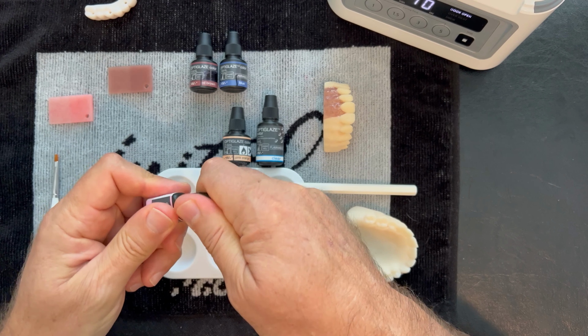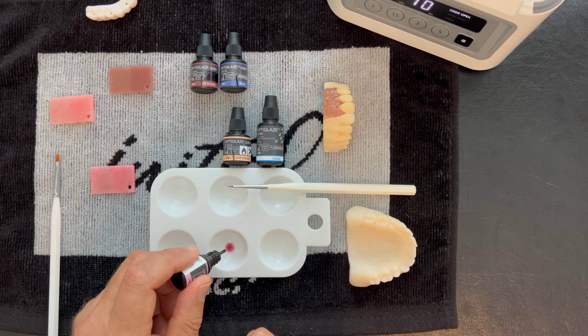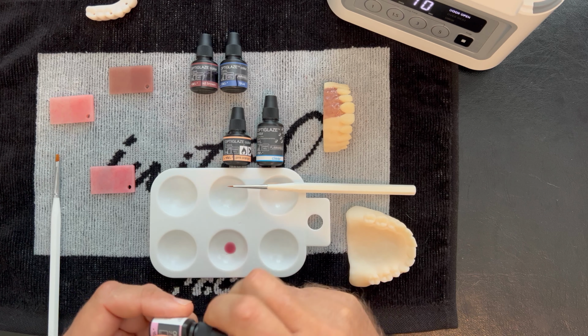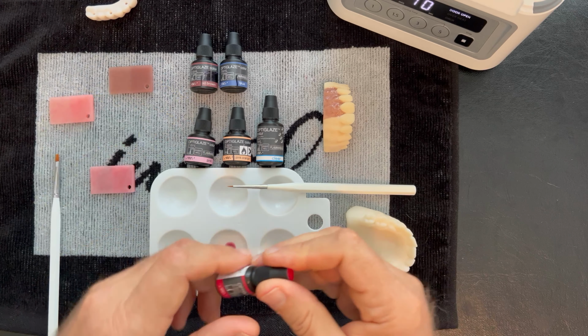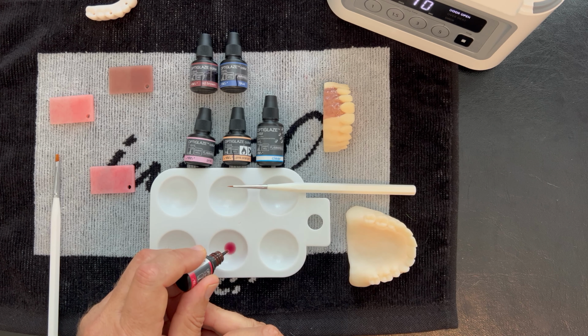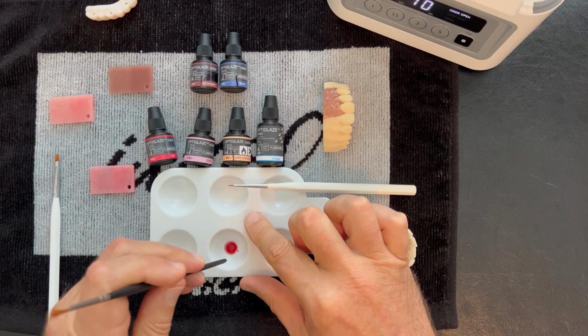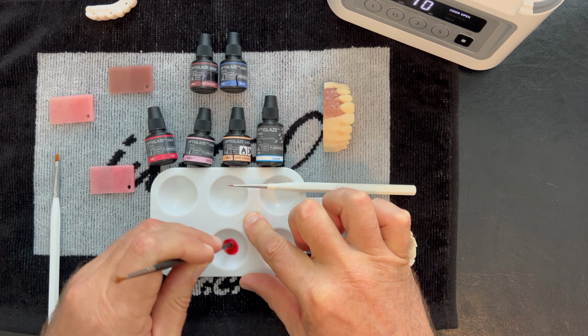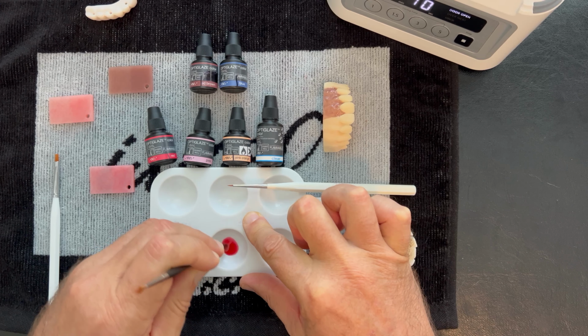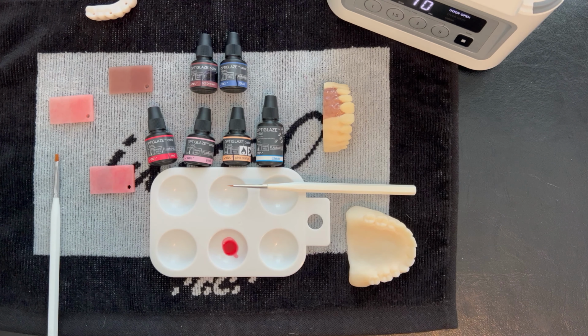You do need to shake these well, and it's important to dose them out by drops. This particular ratio is going to be 2 drops of pink to 1 drop of the red. Squeeze these slowly. You'll get consistent drops, which will result in consistent results of color reproduction. Give that a good stir. This material doesn't just come together just because it's dropped in the same well.